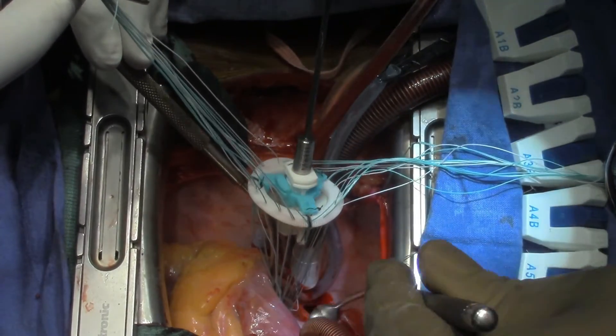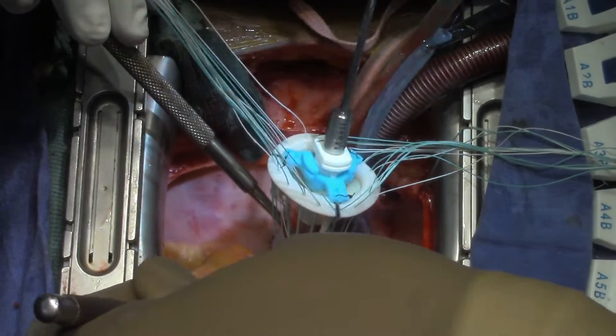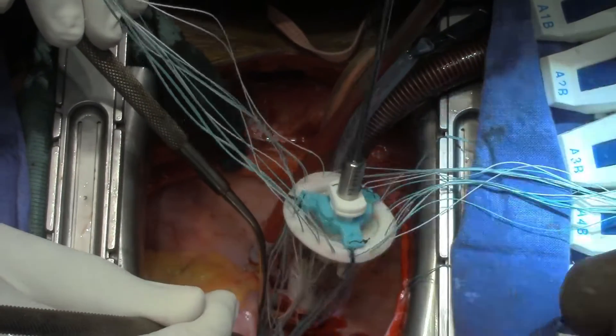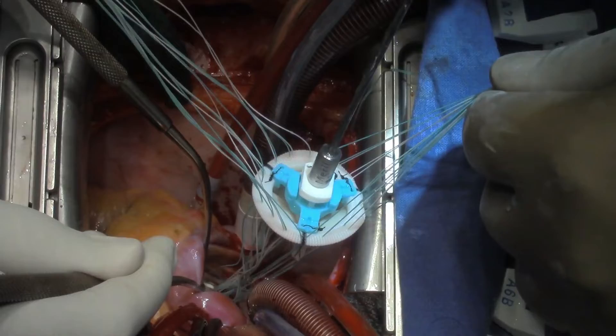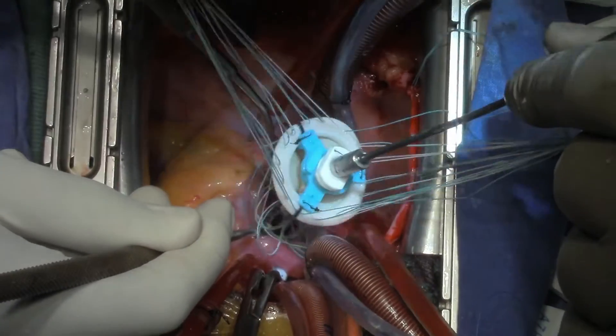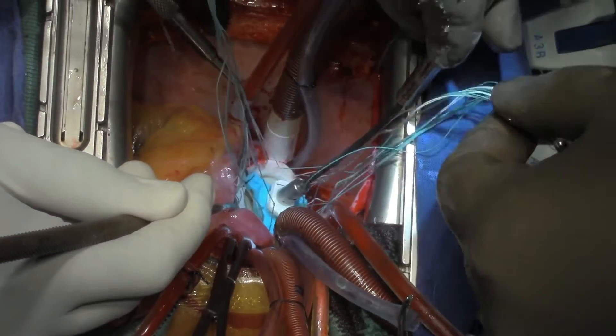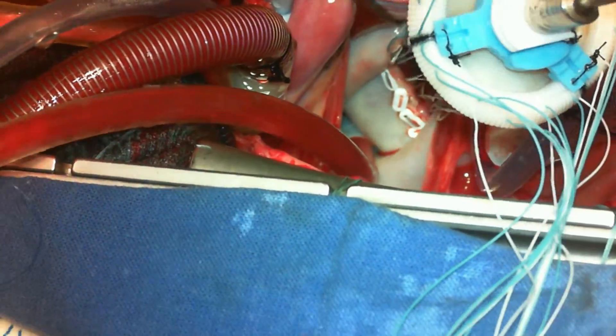We use small instruments — as you can see, the VSD retractor is used here. These are all small profile instruments, and then you can parachute the valve into the left atrium and then onto the mitral annulus. One should not touch the skin while the valve is being gently pushed into the LA.